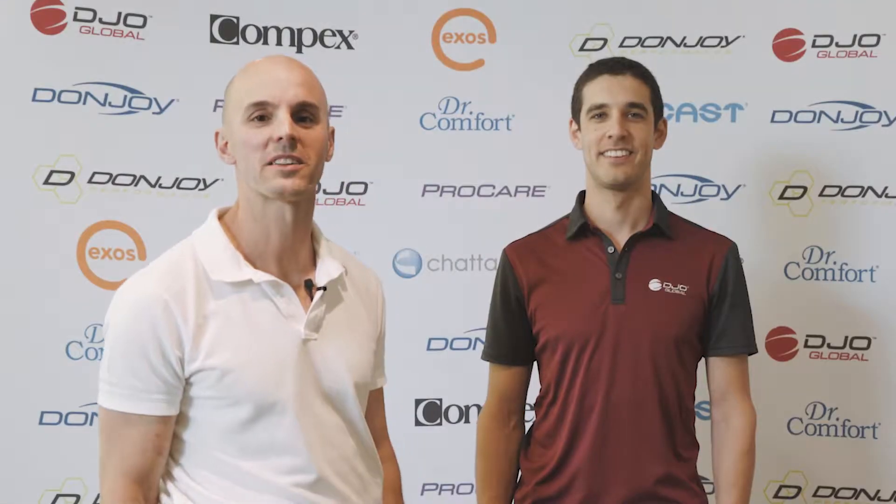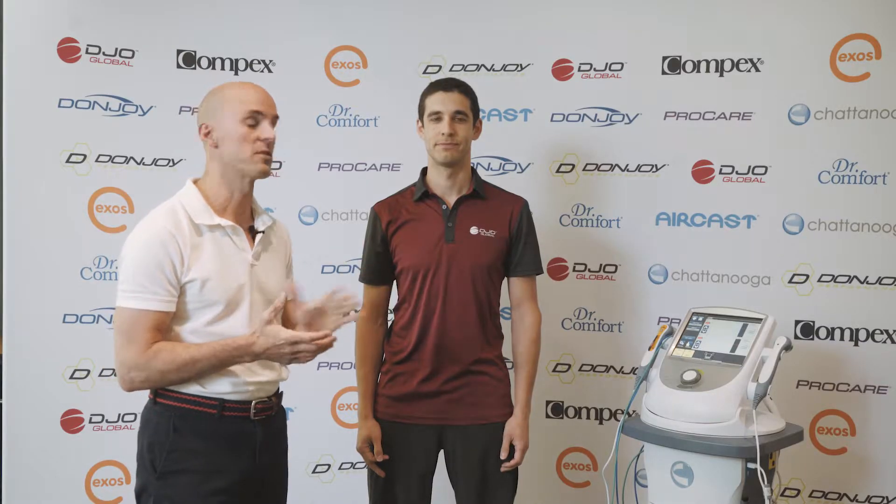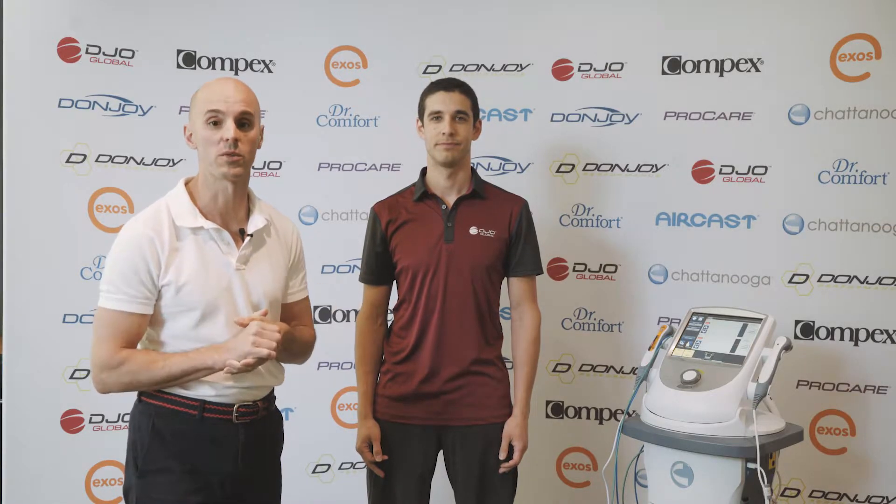Andrew Richards here today, chiropractor from Well-Aligned. This is Ryan and today we're going to be looking at glute activation, and we're going to be using the EMG biofeedback which is a dual channel device to tell us a lot more about what's going on.